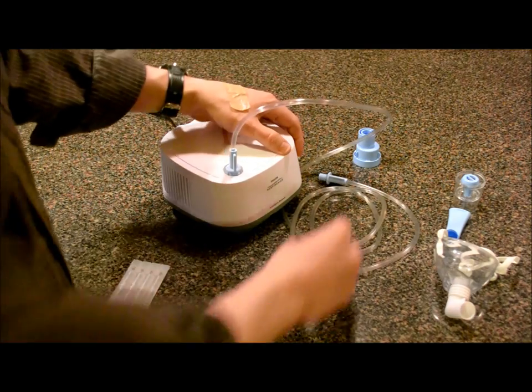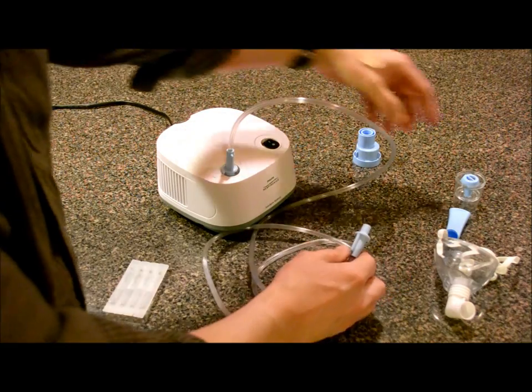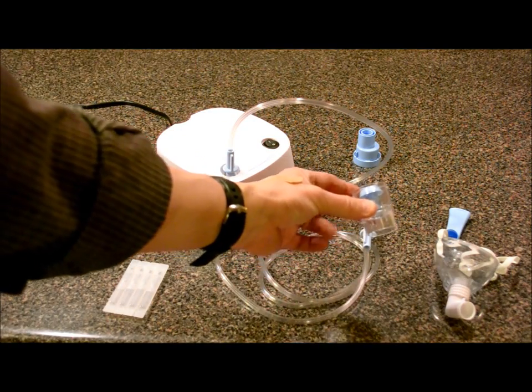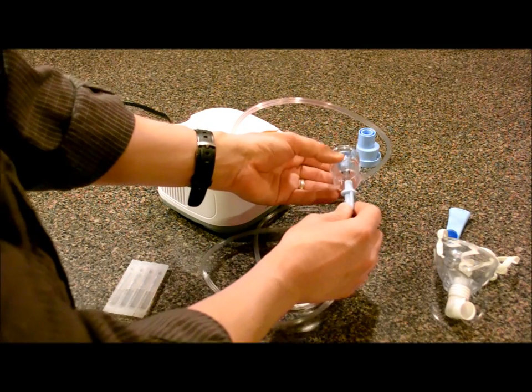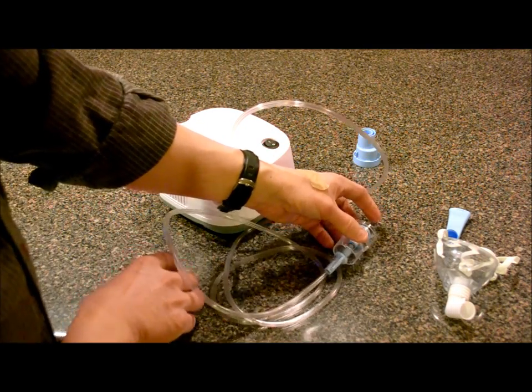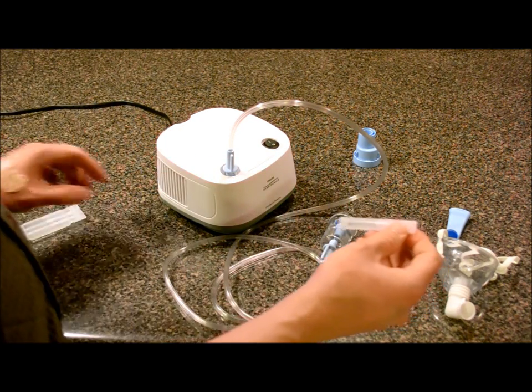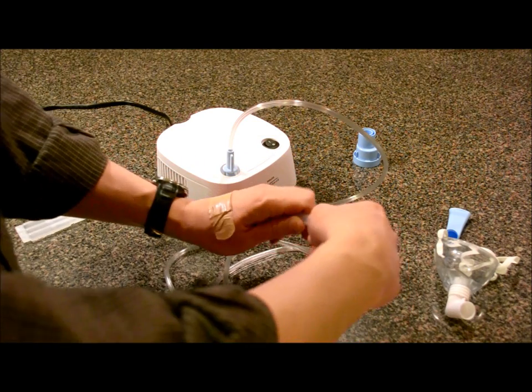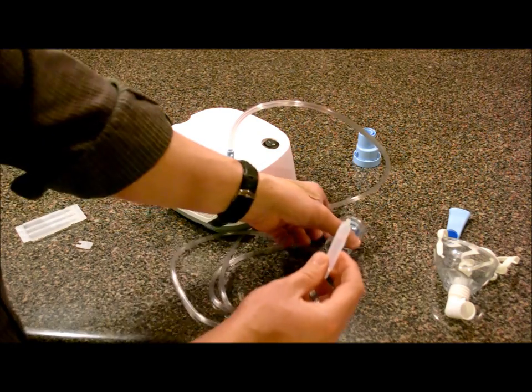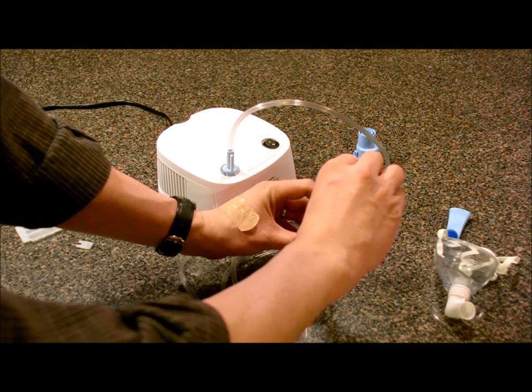Once you do that, take the other end — it's going to be a couple of feet long — and this is going to go into the bottom of the reservoir. That's connected there. Now, the medicine comes in little bullet shapes, little plastic vials that you break off. Take the tip off, hold it upright, and just put the medicine in the side — squirt it in there.